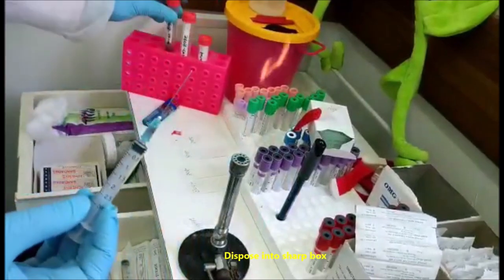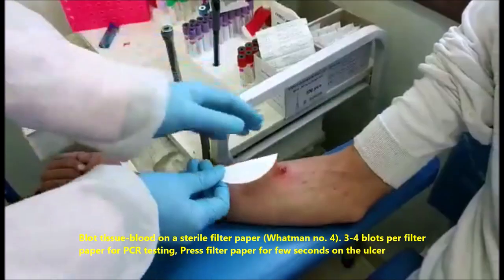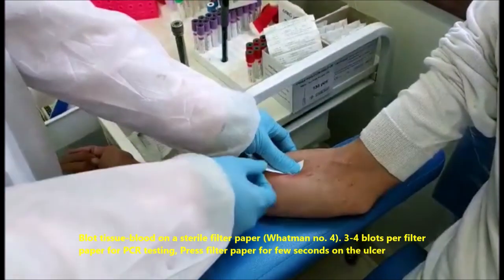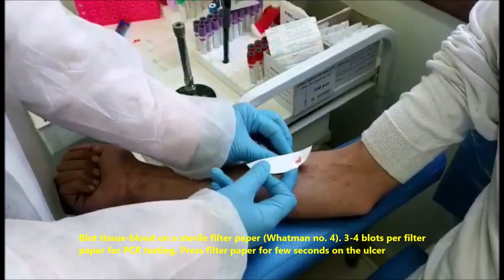Dispose of sharps in the sharp box. Blot tissue blood on a sterile filter paper, Whatman number 4. Perform 3 to 4 blots per filter paper for PCR testing. Press the filter paper for a few seconds on the ulcer.